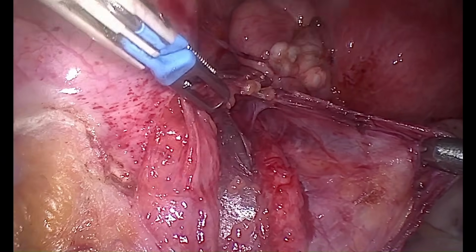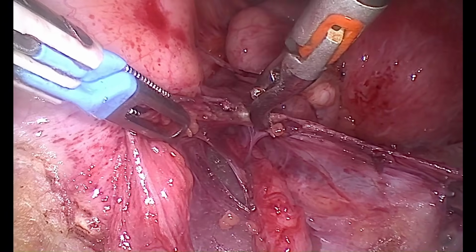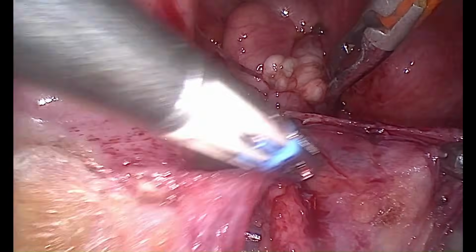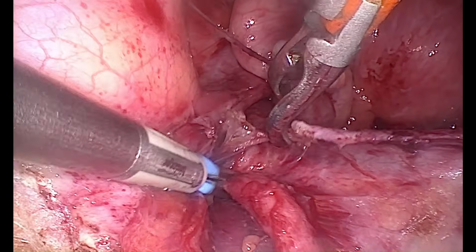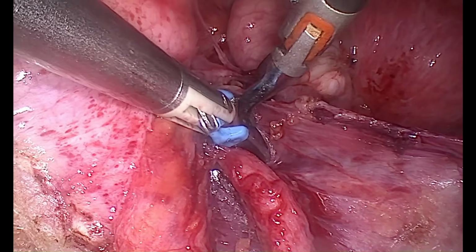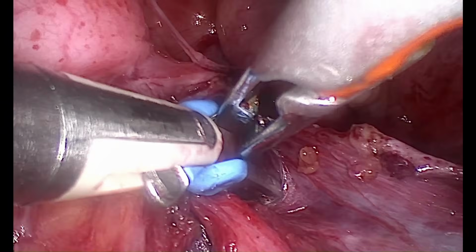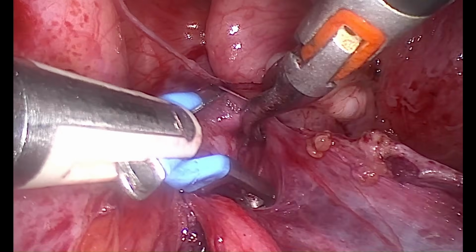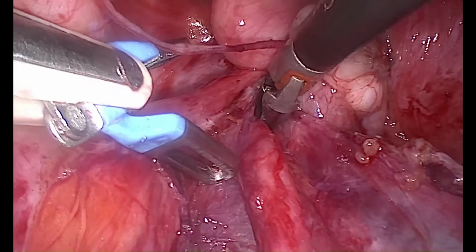Here you can see the ureter has endometriosis. Usually the endometriosis of the ureter is of two types: intrinsic and extrinsic. The extrinsic endometriosis causes puckering of the ureter from all sides and narrowing of the lumen, and once you do a dissection, the hydroureter or the ureteric pathology is going to resolve. But if it is an intrinsic pathology, wherein the endometriosis starts from within, like bladder endometriosis, you need to do a resection of the ureter and a new anastomosis with the bladder.